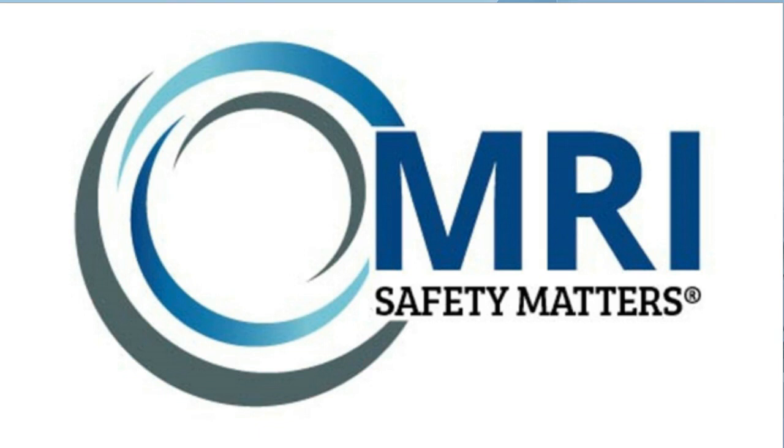Thank you. Next one. You mentioned that having pockets in MRI is a source of danger. Why are staff not checking them before accessing the scan room? I know. Why are they not checking them? Time and time again, it seems that items get missed. And I've got lots of examples. I don't know why, it's the human failing. We think we've checked things. We haven't checked things properly.